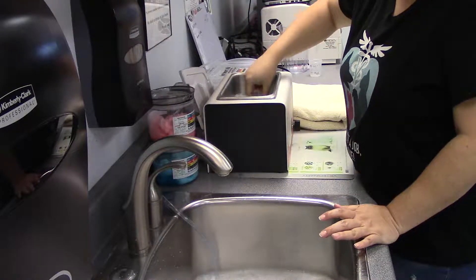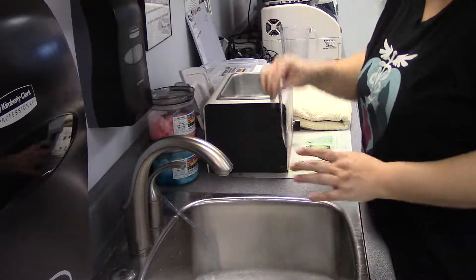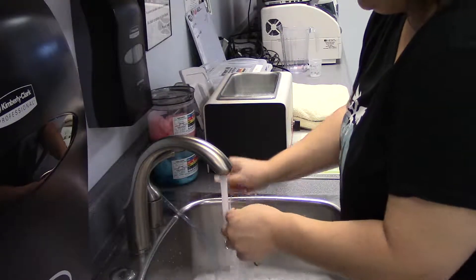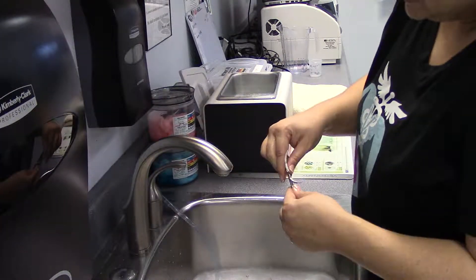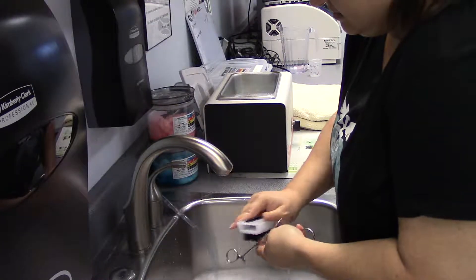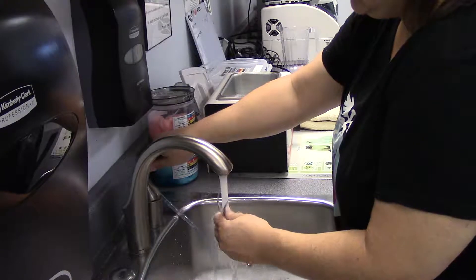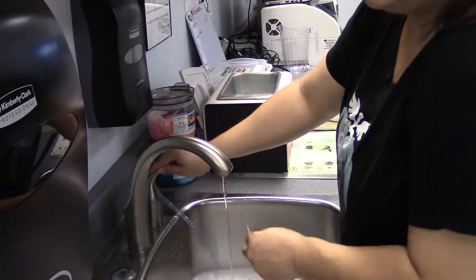After five minutes, we'll take the instruments out and we'll rinse them again. We'll scrub them a second time. Make sure to rinse all the soap off.